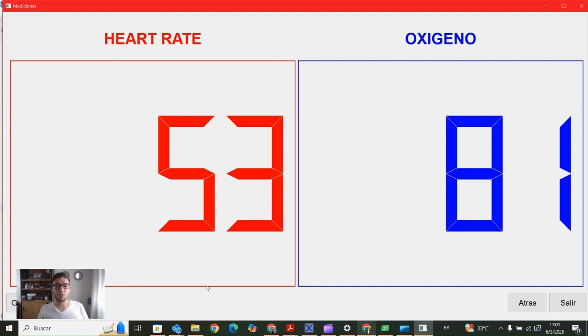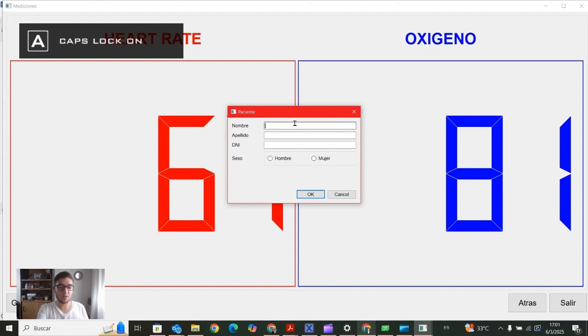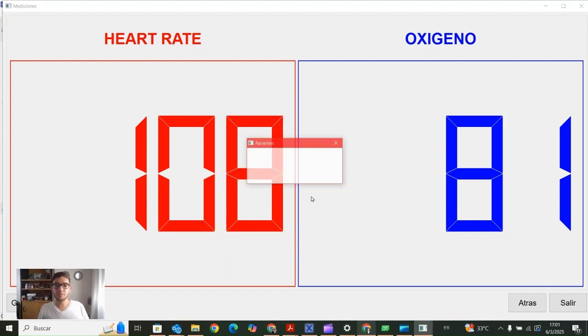Now we suppose we have another patient that is using this oximeter. We click again on save. We choose, for example, the name of my brother, Juan. Then surname, well, the national identity number, just the number, to save. Oh, a new patient has been saved.